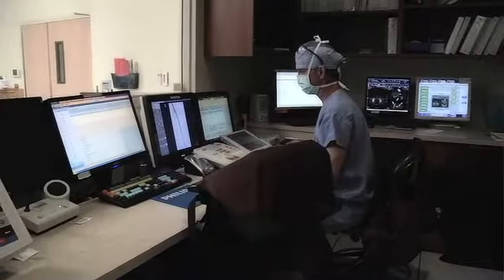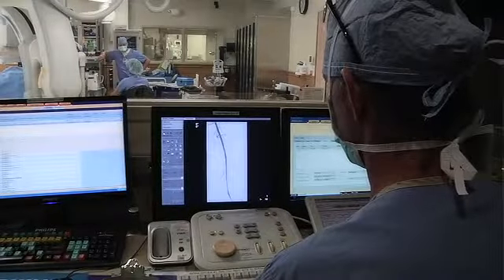High-definition X-rays and contrast angiograms will appear on a monitor, allowing your surgeon to visualize the aorta and accurately position the endograft with minimal effect on other blood vessels that supply circulation to your kidneys and abdominal organs. When the positioning is appropriate, the graft will expand to fit snugly against the walls of the healthy aorta above and below the aneurysm.